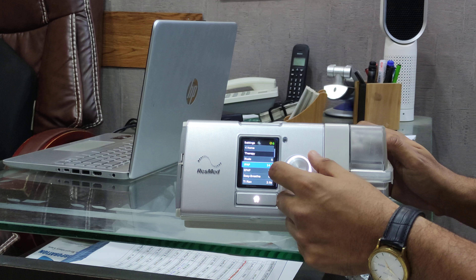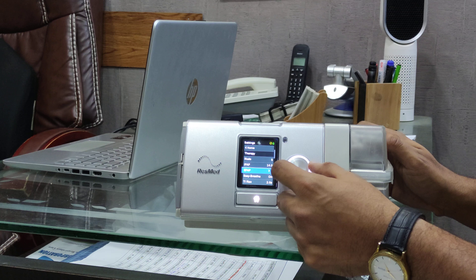To set the BiPAP you need two settings: one is IPAP and the other one is EPAP. Here we are setting IPAP to 16 and EPAP to 8.